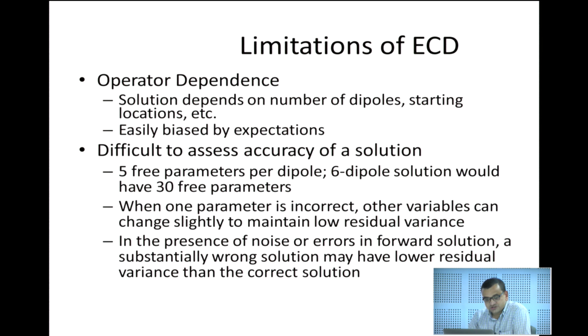So ECD was quite powerful, because it is one of the very few software packages available to users who can apply source reconstruction techniques. It is quite popular, and people still use it, but it is very much dependent on the operator, because you need to first choose quite a few free parameters, and the whole procedure can be biased by expectation as well.